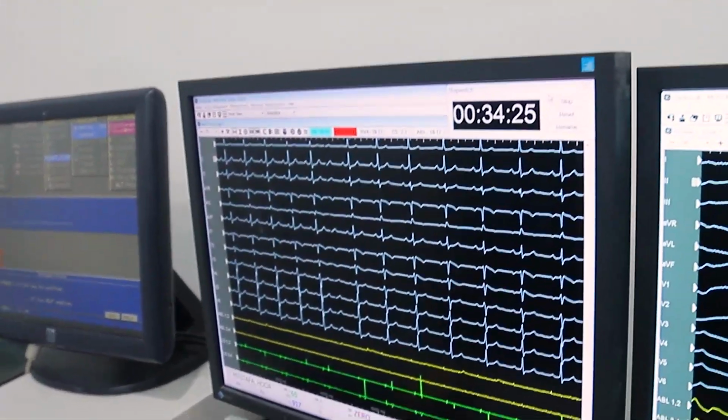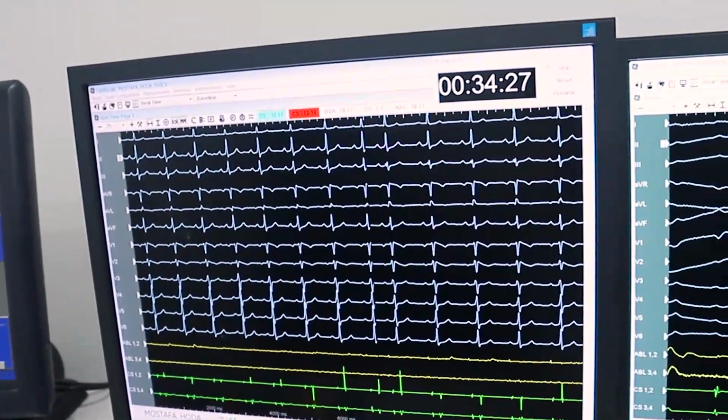That was perfect. Now here, look at the ECG running now. This is 34 minutes. End of study!